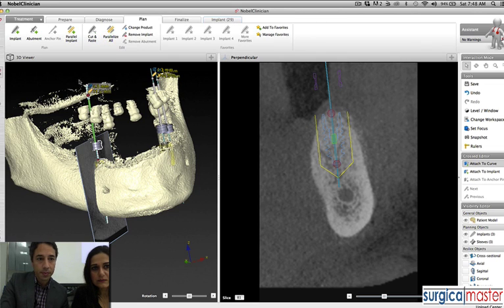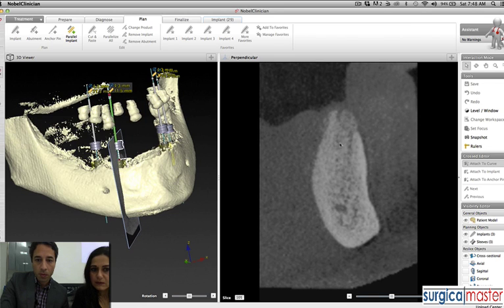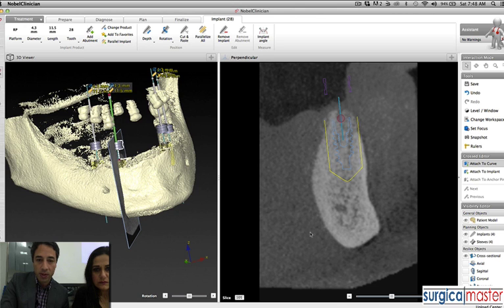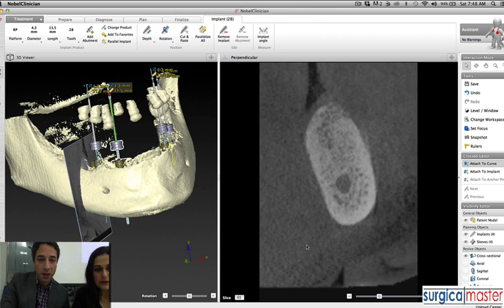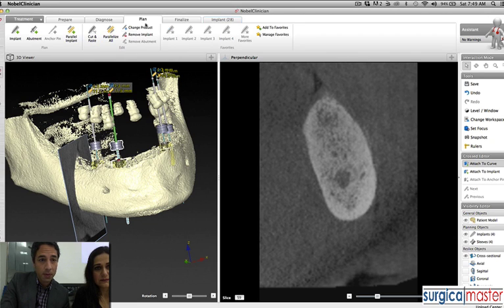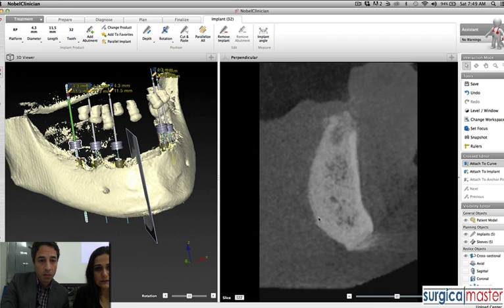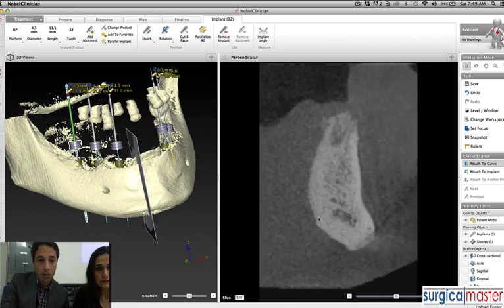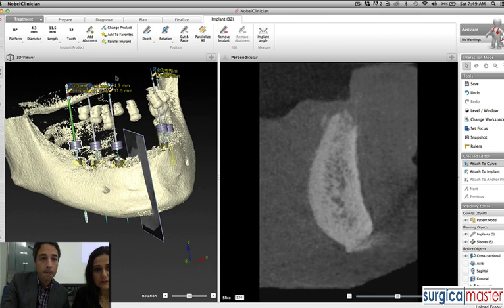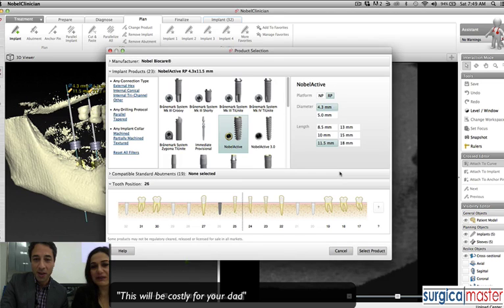We'll take another position and parallel an implant to it. So we have two parallel implants — now I'm going to add one more distal. Your dad is blessed with very good bone. He's in good shape. He's 85 years old? Yeah. Amazing bone. We'll add another parallel implant in the posterior.